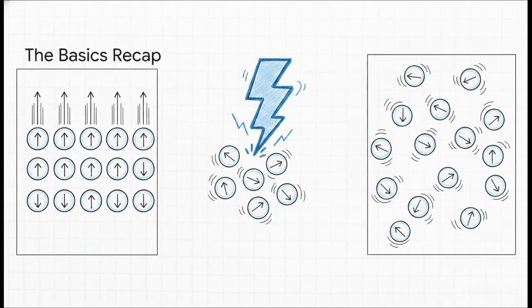Okay, let's do a super quick, under 1 minute recap just to set the stage. We know MRI relies on hydrogen protons in the body. We fire an RF excitation pulse to flip them into transverse magnetization so we can actually read their signal. But almost the second that pulse turns off, those protons start dephasing. They completely lose their synchronization. The TR is how often we repeat that pulse, and the TE is when we listen for the echo.